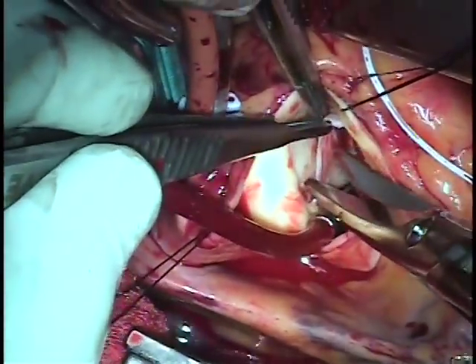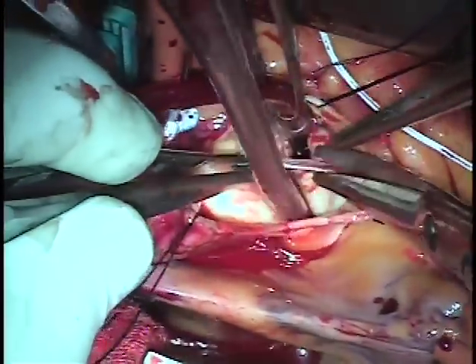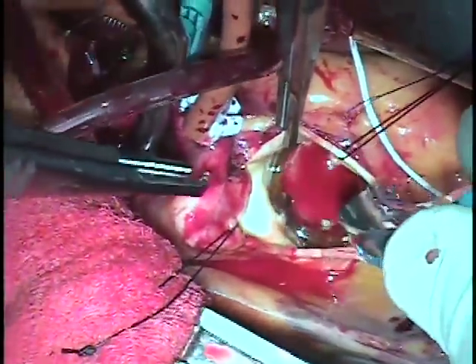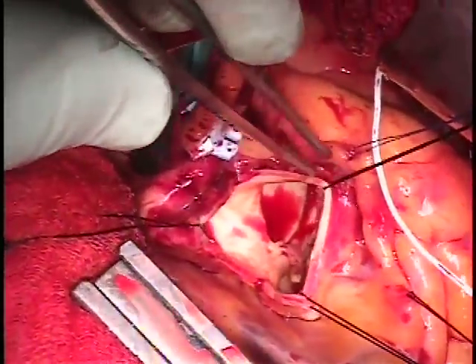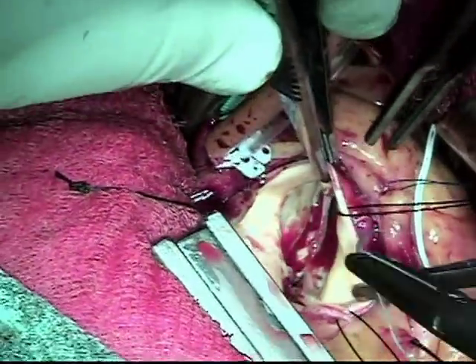This is a patient that unfortunately we couldn't repair the aortic valve. We do a lot of aortic valve repairs — in fact we just reported the biggest series in the world and the results have been excellent. In this patient we excised the leaflets, sized with the Inspiris Sizer for the valves, a size 25, and then I'll show you the steps we use to put in the valve.